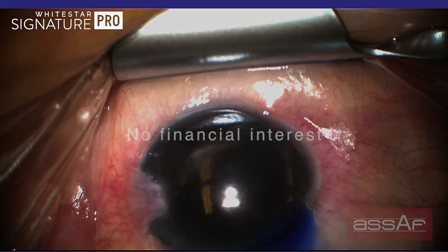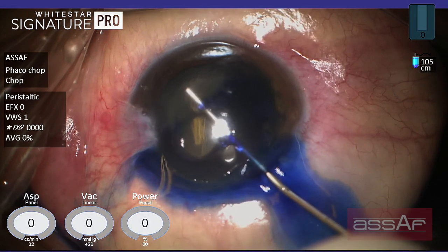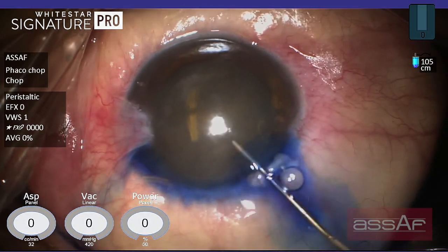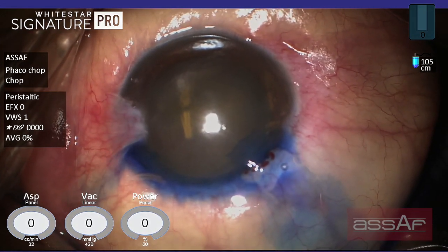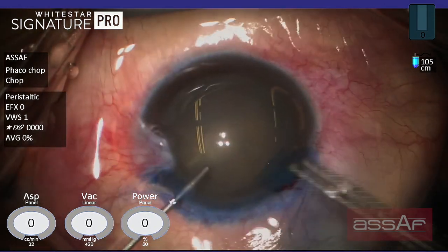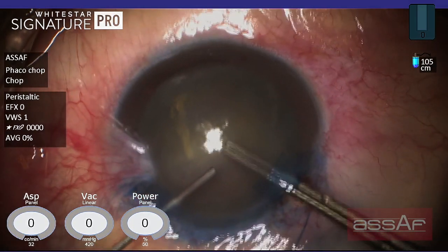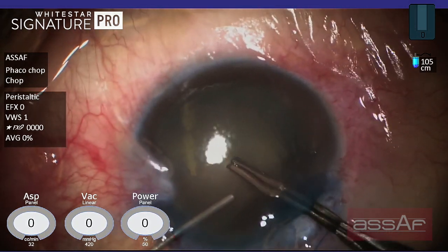Now staining the lens capsule with trypan blue. Injection of dispersive OVD to wash out the stain from the anterior chamber. I prefer to apply the soft shell technique by injection of cohesive OVD underneath the dispersive OVD to protect the corneal endothelium in such dense hard cataract. Now proceeding to capsulorhexis formation, starting with the utrata forceps.